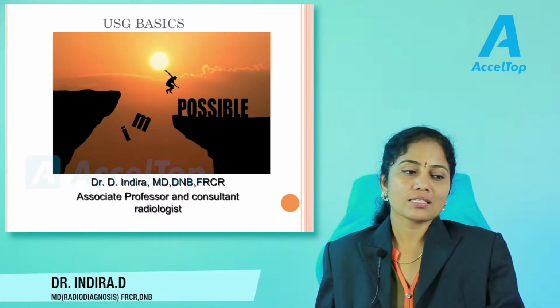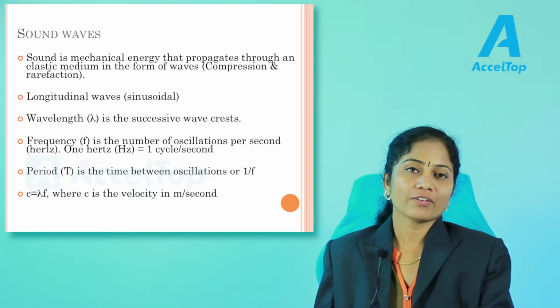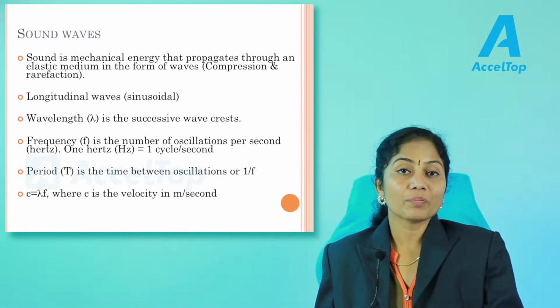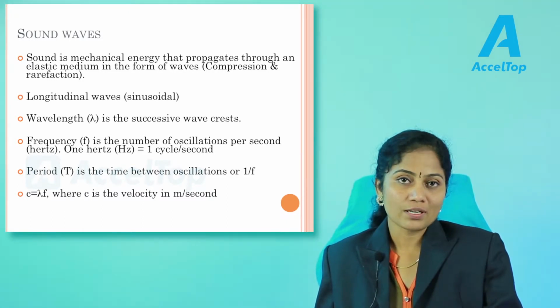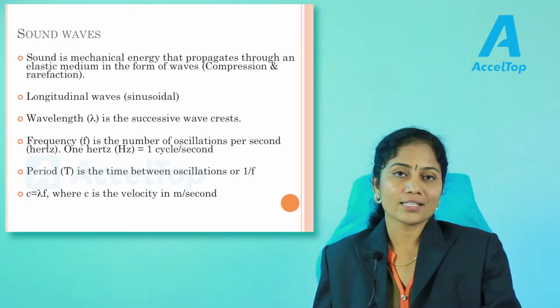Today I am going to discuss the basics of ultrasonography. Ultrasonography is a very important modality in imaging children and also pregnant patients. We know ultrasonography uses ultrasound waves, and ultrasound waves are non-ionizing radiations, unlike X-rays, which are ionizing radiations.